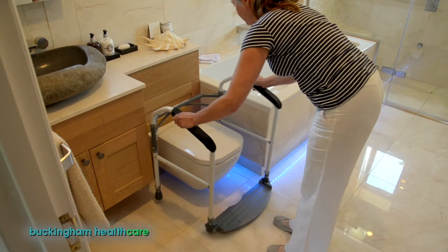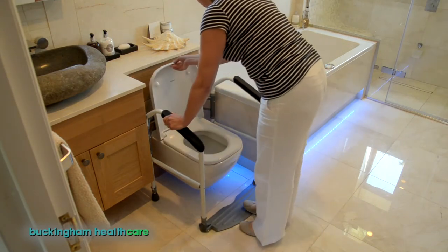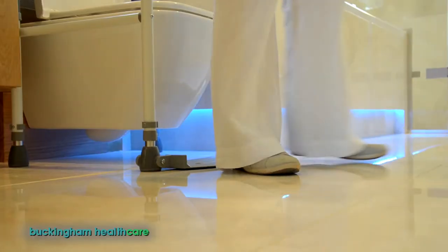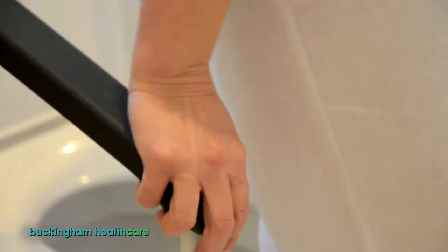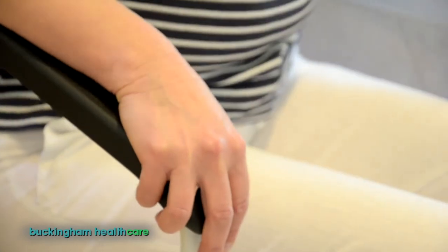Move the FoldEasy into its final position, then turn around, place your feet on the footplate for added security and, using the ergonomic armrests, safely and comfortably lower yourself down.